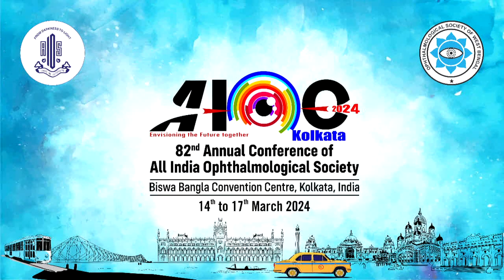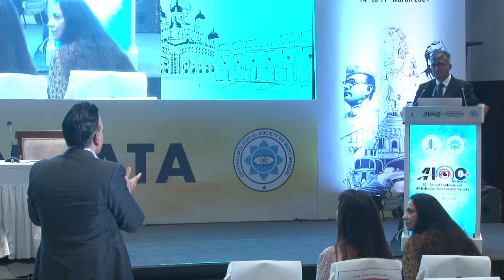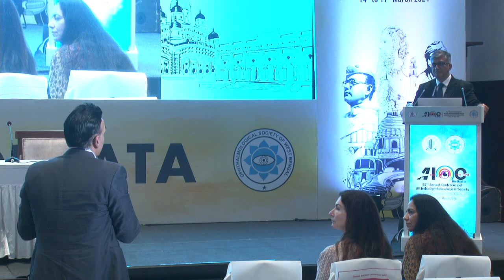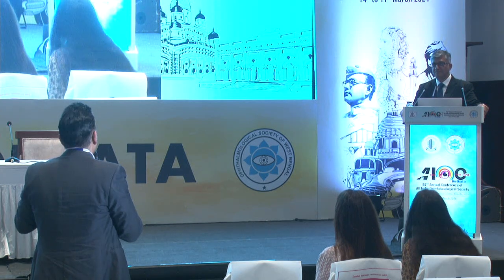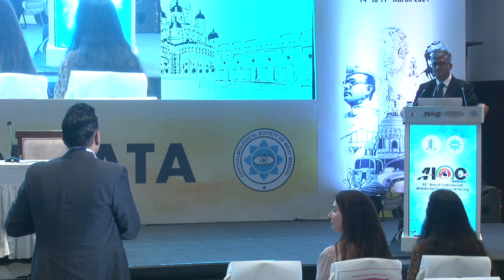Okay, Prashant, I just wanted to ask a question. One of the things that I think in some of the more severe cases is whether the patient's wearing a contact lens, because that will, of course, affect your IOL power as well. If you know that they're going to go back into a scleral lens or something like that, then that will give you a sort of larger landing zone for the IOL. And I found that it's a lot easier, to be frank, if they're going to wear a lens afterwards, because then you can be a little bit more liberal with the lens choice that I'm going to put in. That's one thing I was going to say.